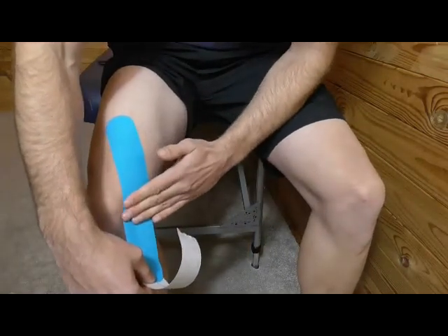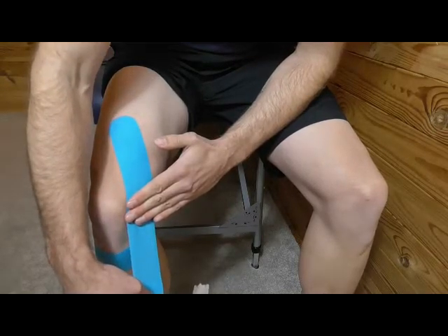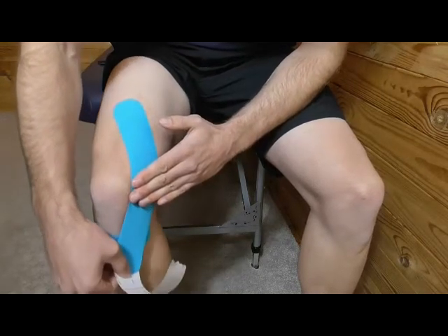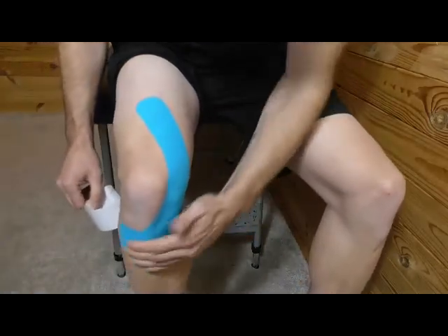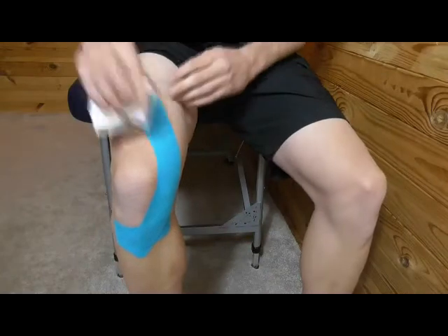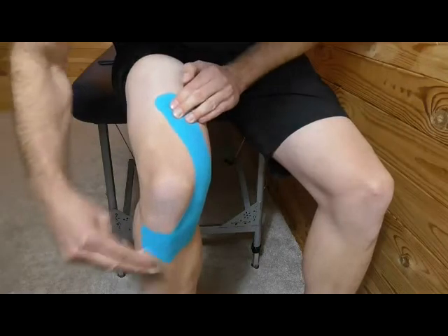When you get to the kneecap, stretch it a little bit more — go to 100%, then back off to about 50%. Then place that around onto the tibial tuberosity. Warm up the tape to activate that glue.